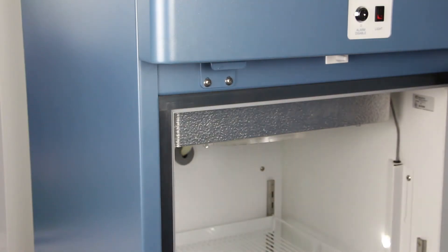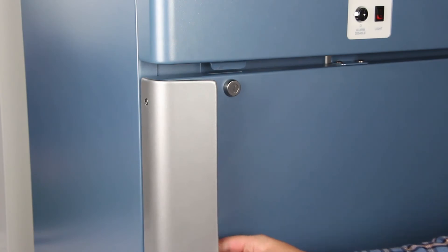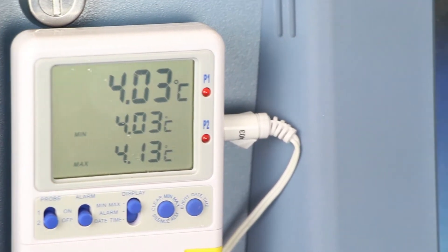Close the door and allow the chamber temperature to stabilize. Observe and note the thermometer temperature.